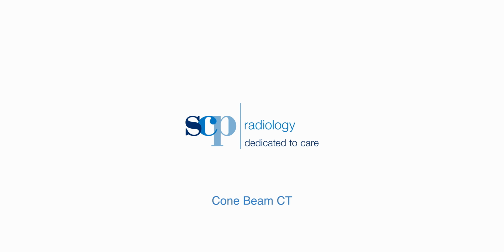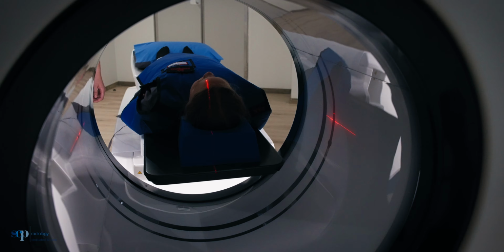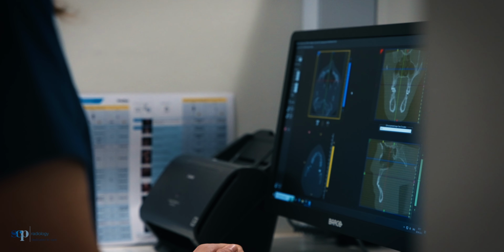So people often ask what the difference is between a CT scan and a cone beam CT. Basically, you get exactly the same information from a bony point of view, so temporal bones. We use it a lot for extremities, so wrists, elbows, shoulders, all the small joints.